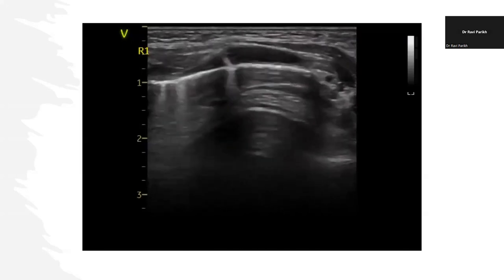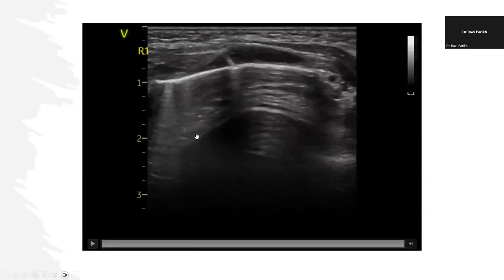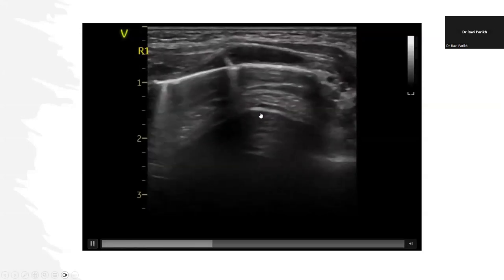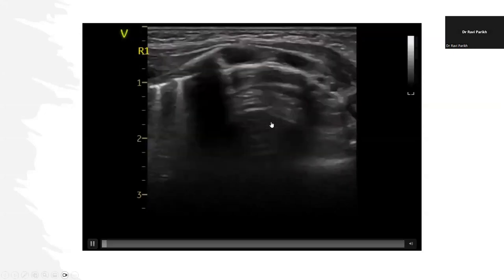And there's a real risk that if I don't follow that fixed structure, I might miss a subtle pneumothorax in this baby, in a baby who's on CPAP, who's in 40-45% oxygen, probably has transitioning lung, has TTN. We've got some lung points, some B lines, but this could get worse. And if I then report this and say, well, it's normal, and I'm not doing a chest X-ray, this baby may end up with a tension pneumothorax on CPAP.